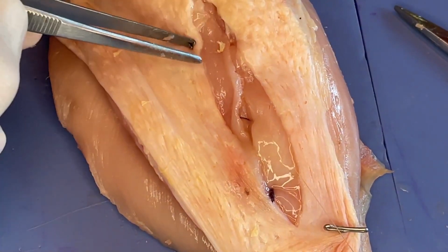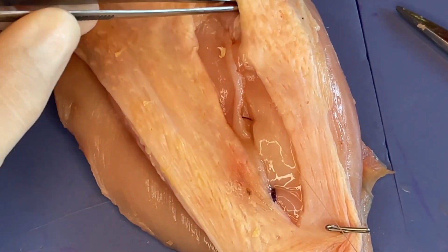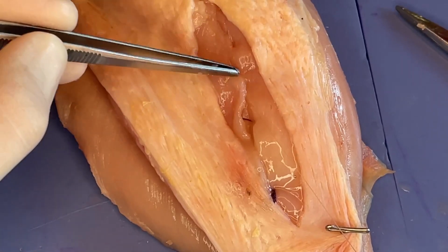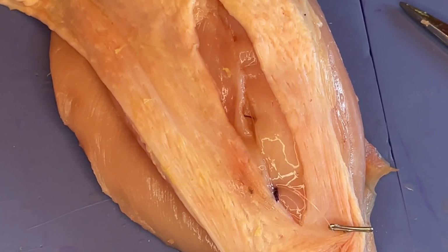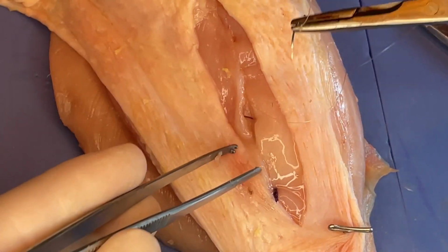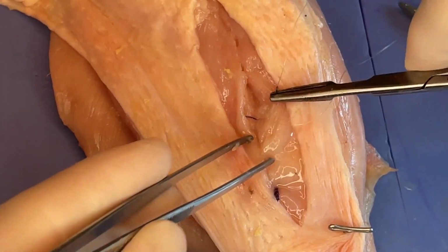Yeah, so again, with how loose this skin edge here is, it's not really trapping it over, but you can see how it's closing this defect very nicely. And with a completely buried suture line, because we buried our knot down in that deeper tissue to anchor it, and now each of the bites that we're taking is actually just right underneath the skin edge.